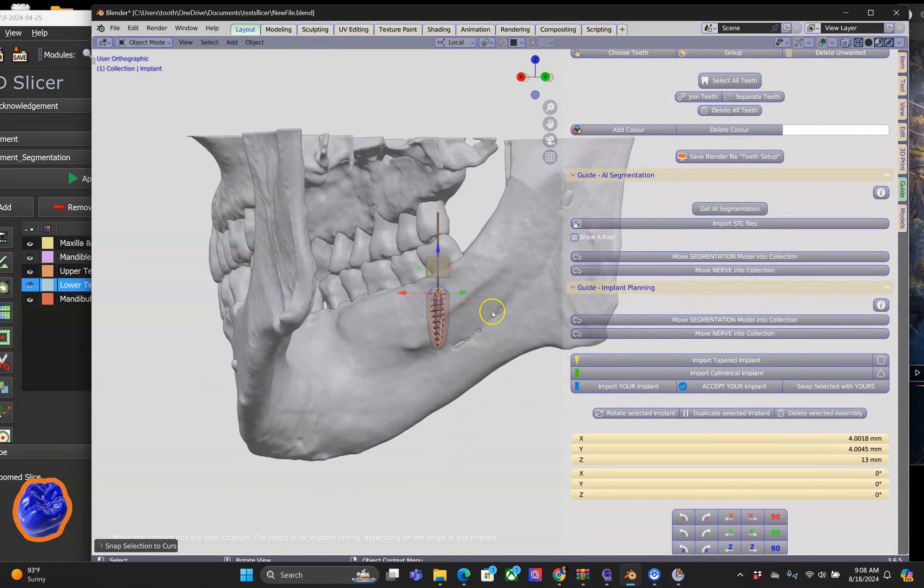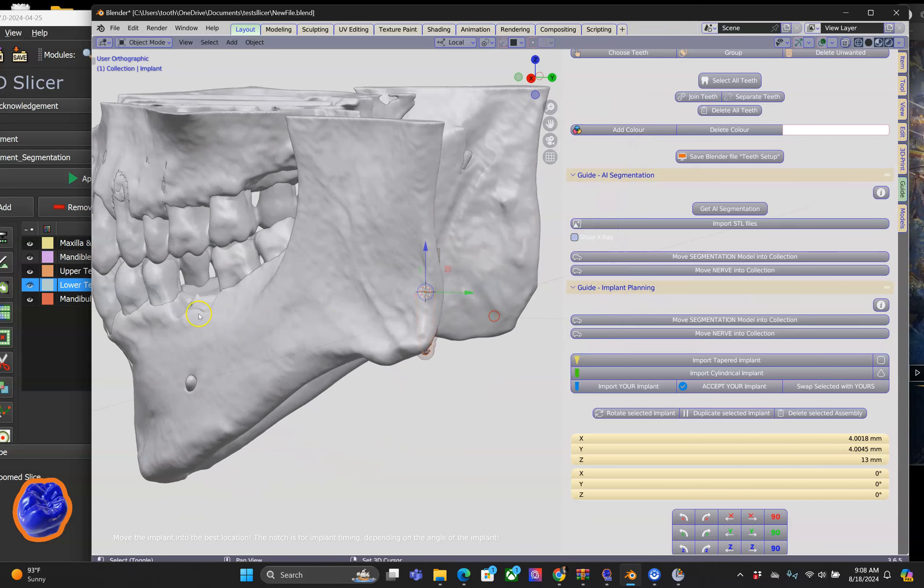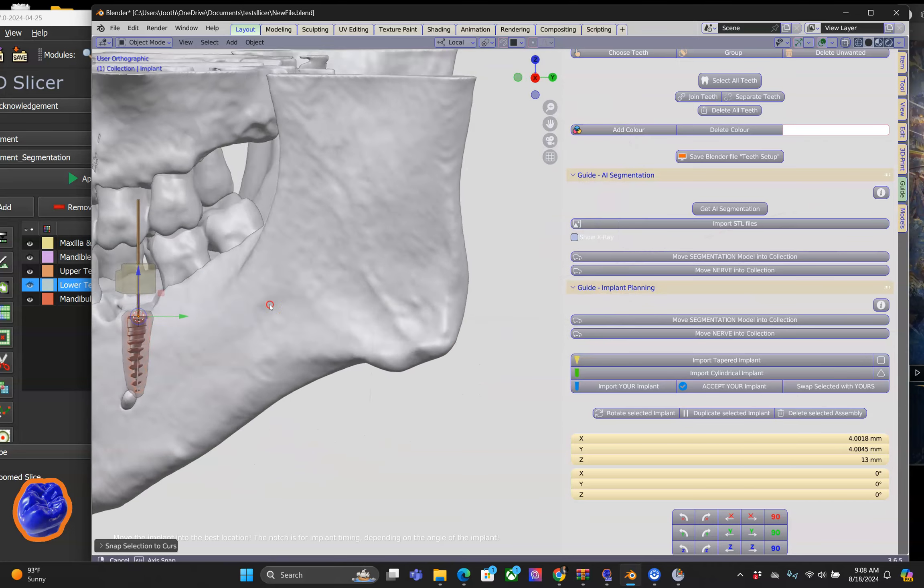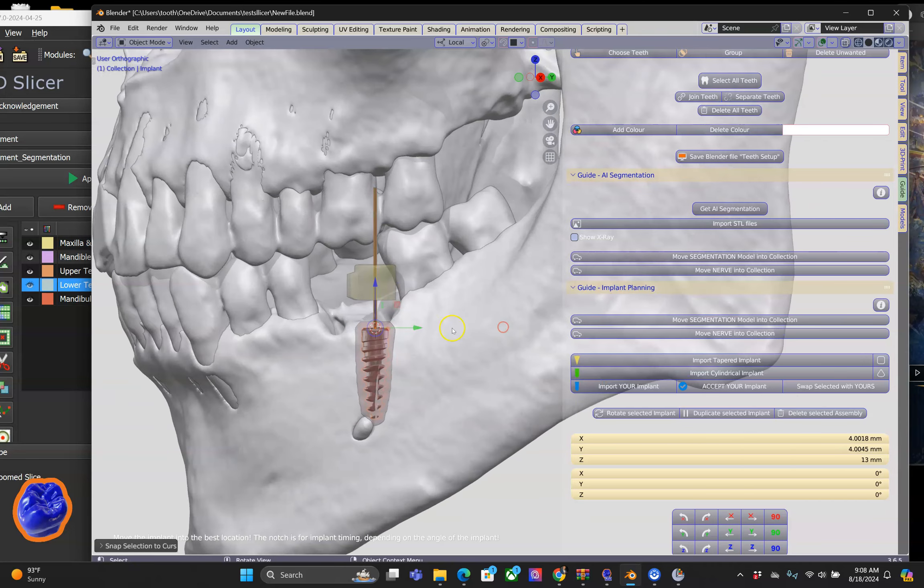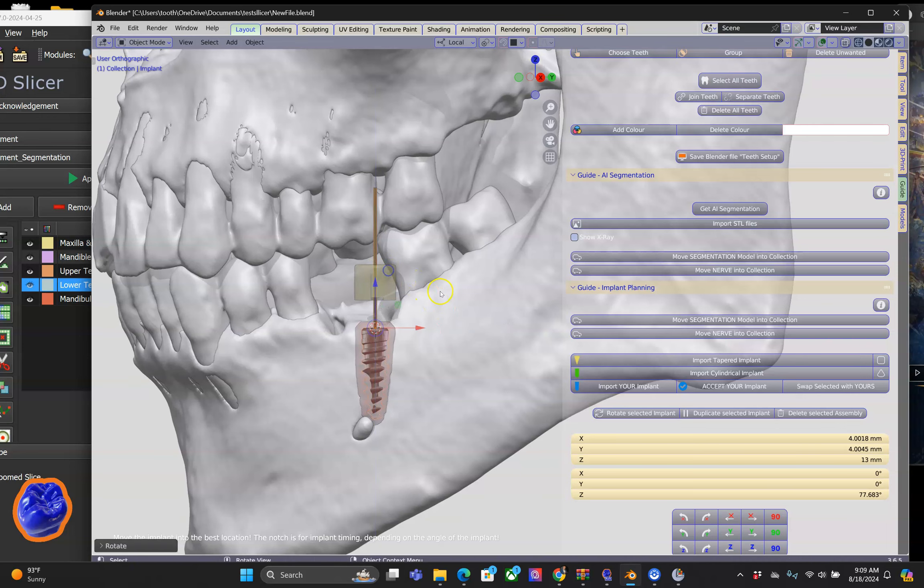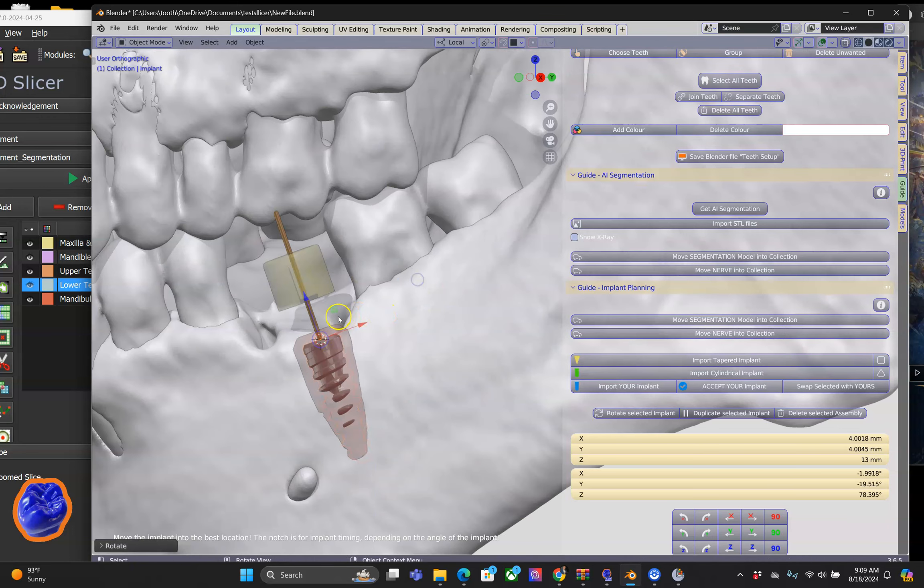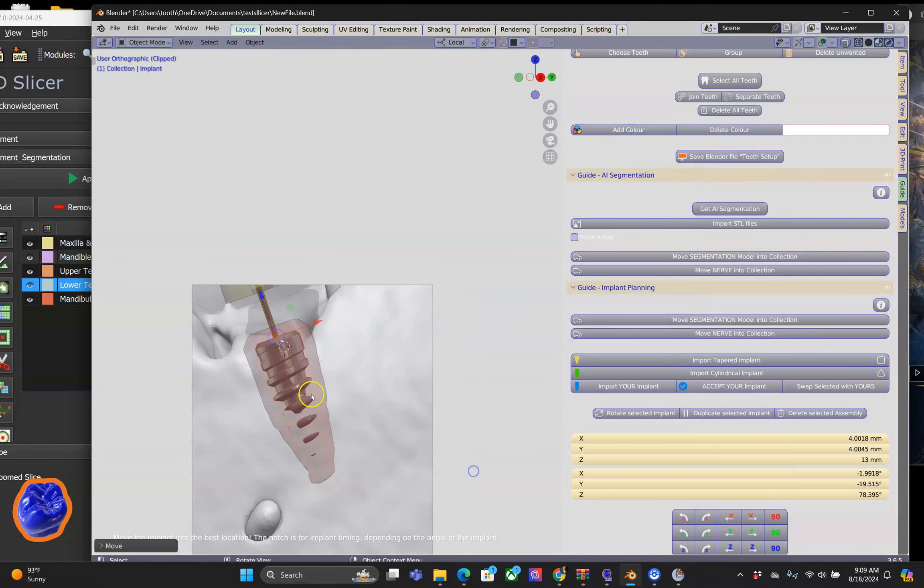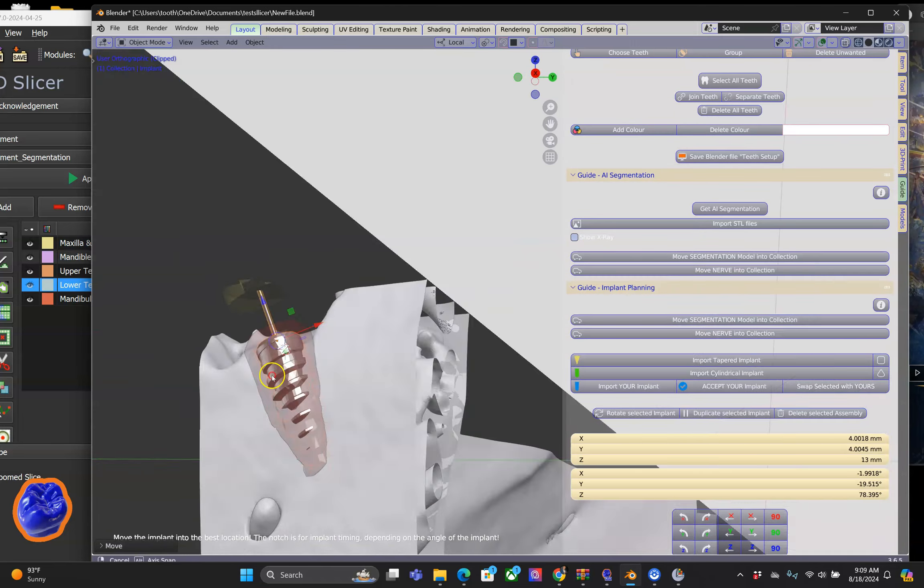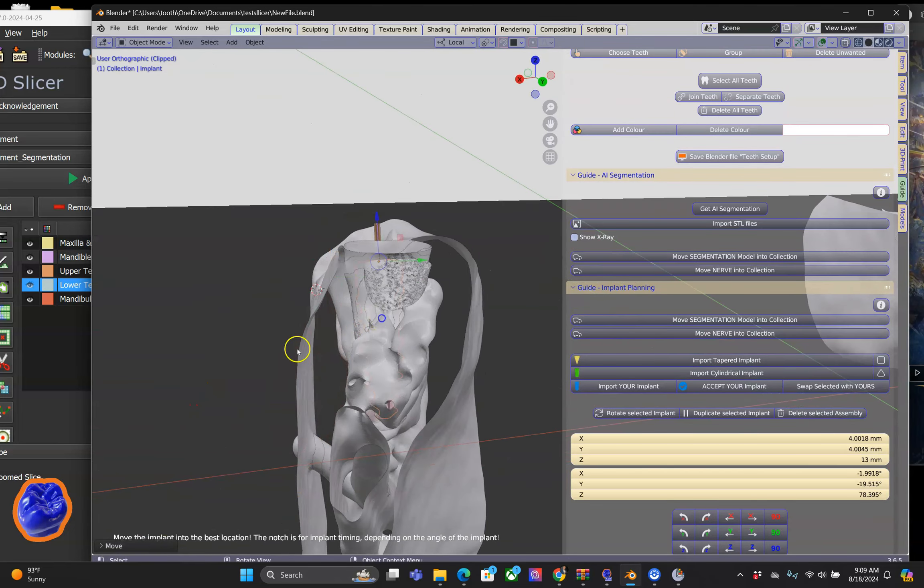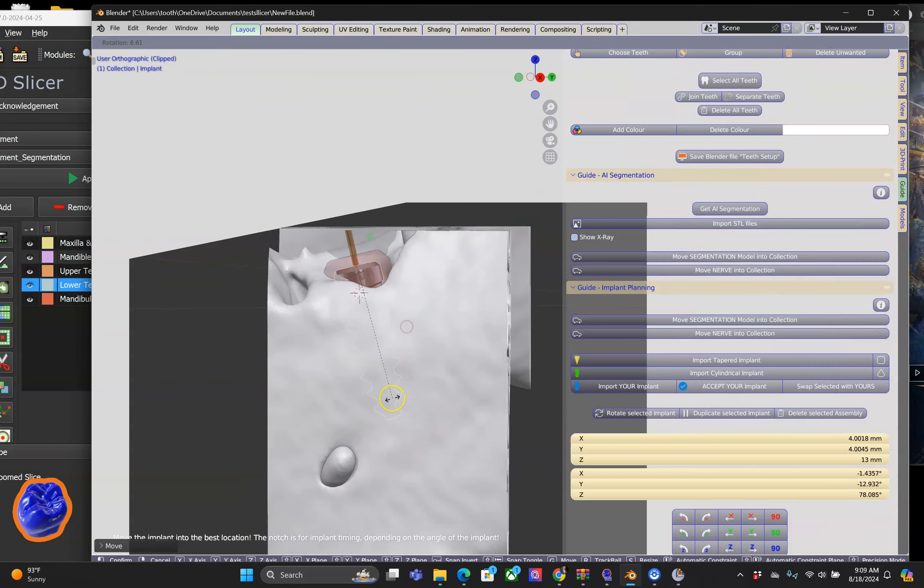You know exactly what comes next, and that's moving the implant to the desired location. This is very similar to moving a tooth in the wax up, for instance.